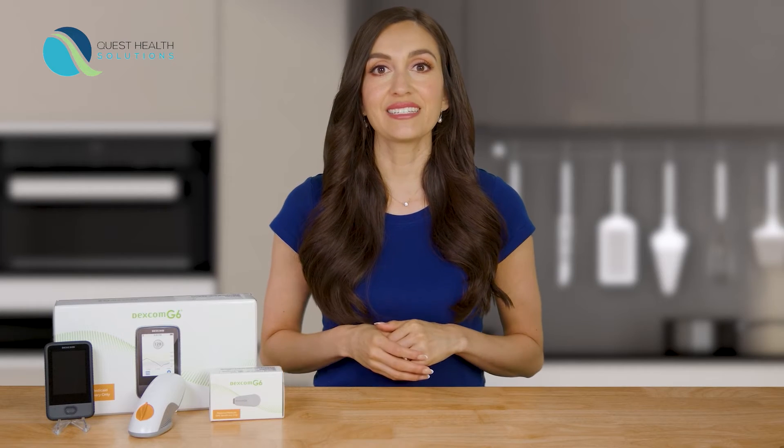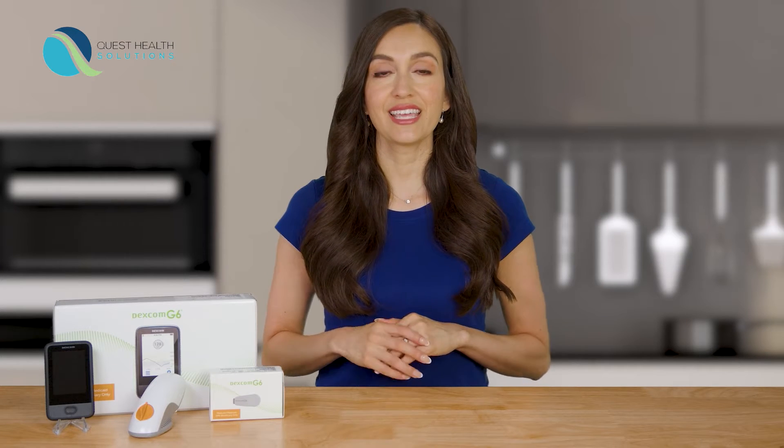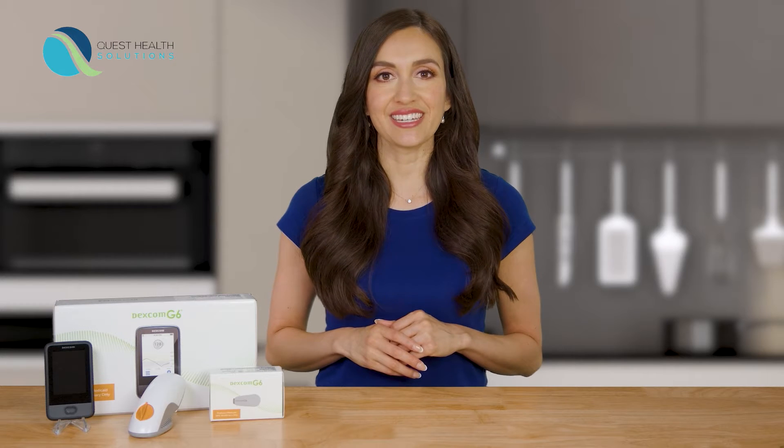Hi, I'm Miranda with Quest Health Solutions. Congratulations on receiving your new Dexcom G6 system. Now you can check your glucose with no finger sticks. The Dexcom G6 is a great tool for managing your diabetes, and it's extremely easy to use.